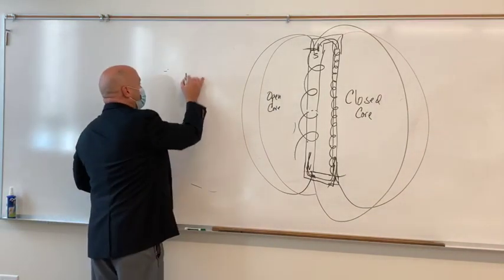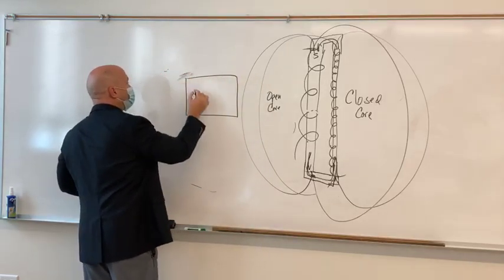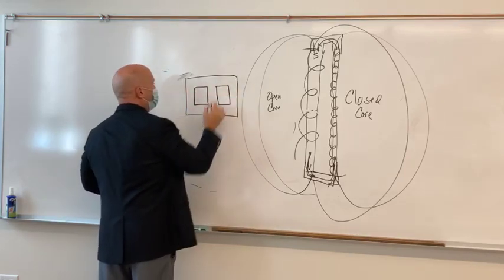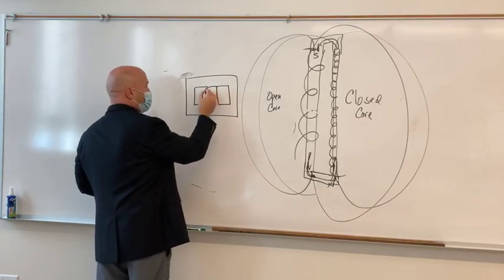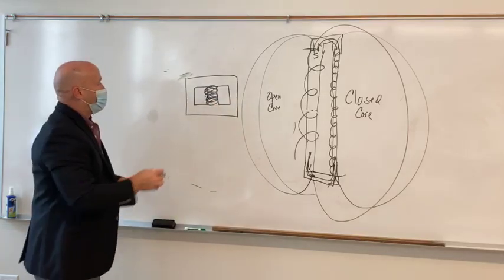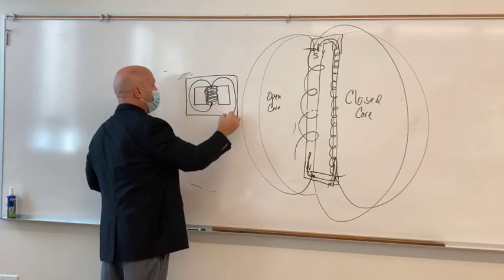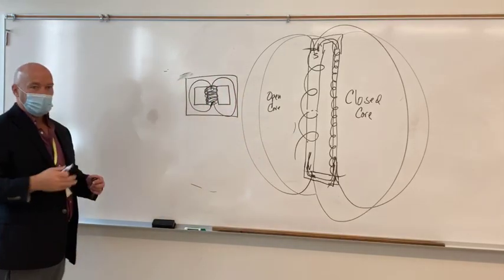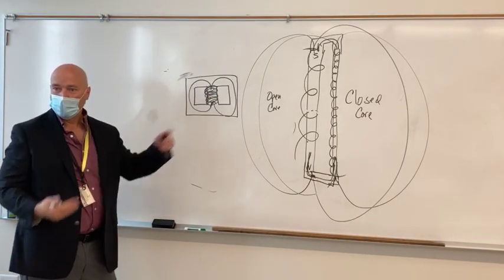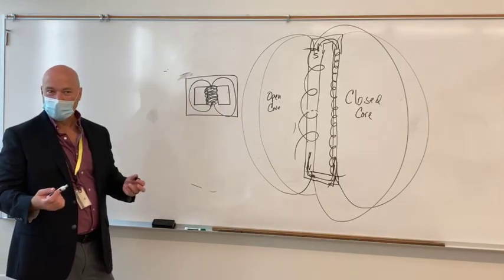So what somebody else came along and did was they built on that, and they said, okay, what if we take two coils of wire, we wrap both coils of wire around the same middle piece. Now our magnetism is going to come out, and it's got a 360 degree, or close to it, avenue of ferromagnetic material to travel through in order to ram that magnetic field up and down through both coils. Does that kind of make sense?